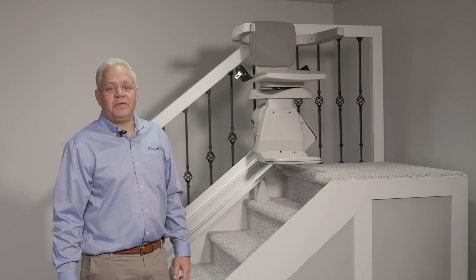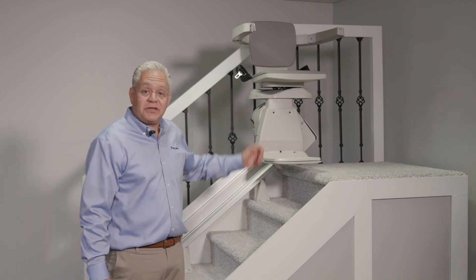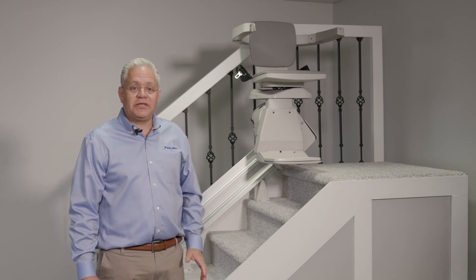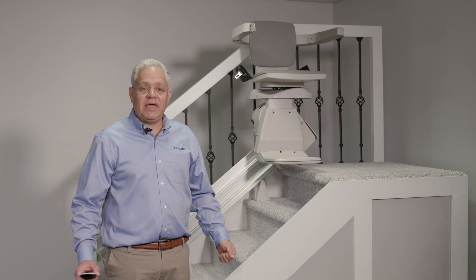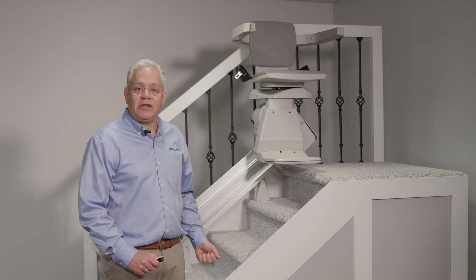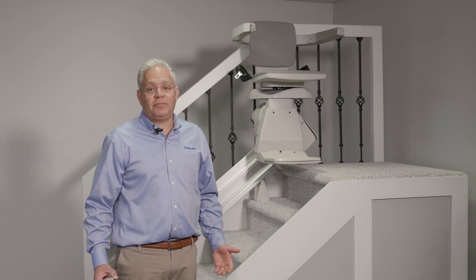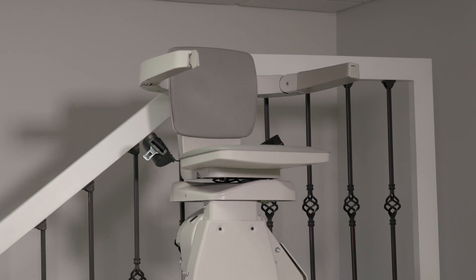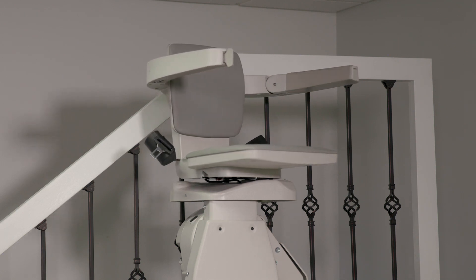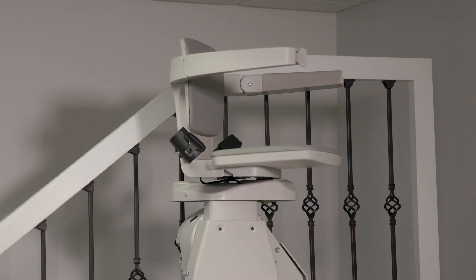Another comfortable feature that many people choose to add is a power swivel seat. At the top of the staircase, on a standard stair lift, you simply push a lever and manually swivel the seat 90 degrees to exit at the top. Some people find that uncomfortable or challenging, so they can opt for a power swivel seat — all you have to do is press a button, and the unit will swivel under power for ease of use.